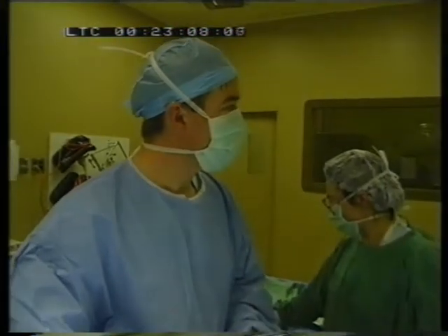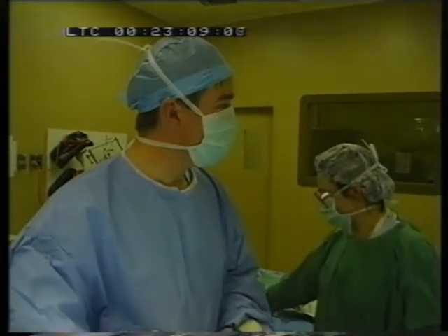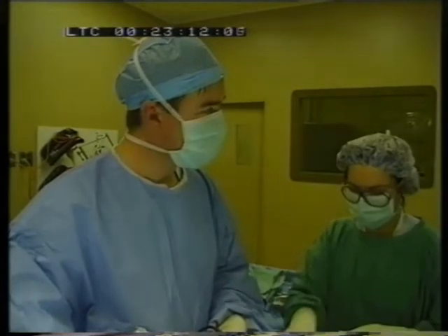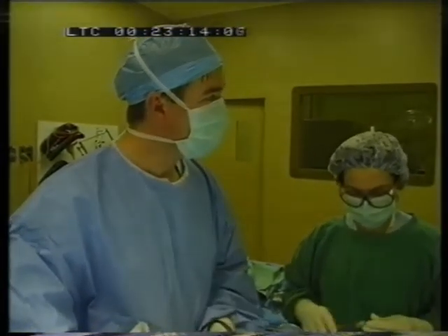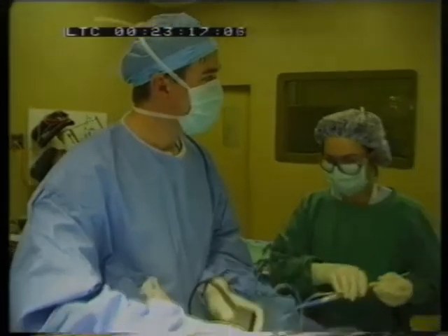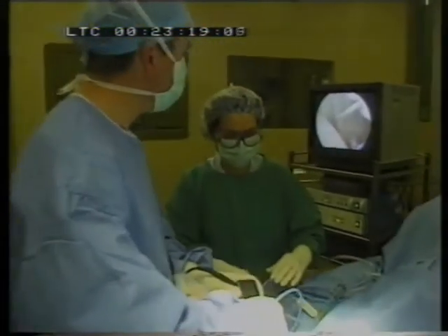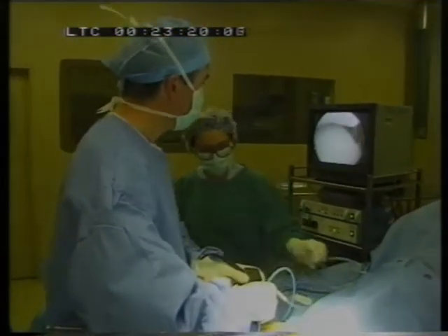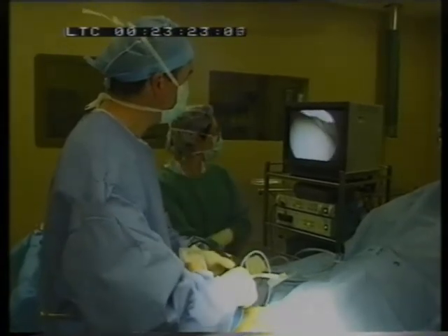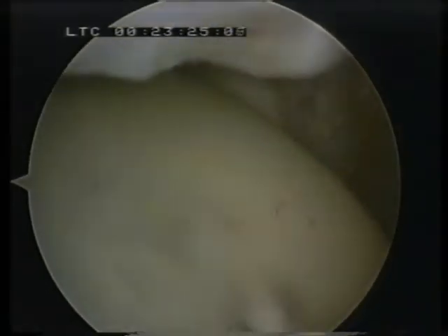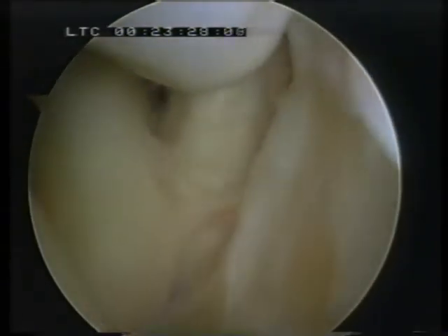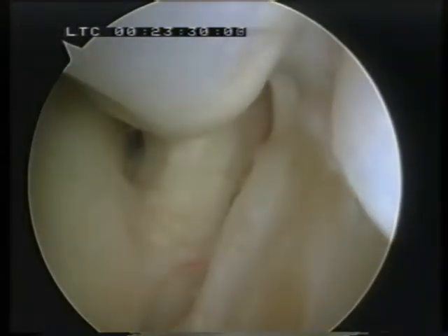Once we get inside the ankle joint, we first confirm that we have correct passage into the joint. This gentleman purely has synovitis, which has been occurring at the anterior aspect of the joint. We can look through this joint quite easily. I'll just point out some of the relevant structures there for you — the anterior inferior tibiofibular ligament.